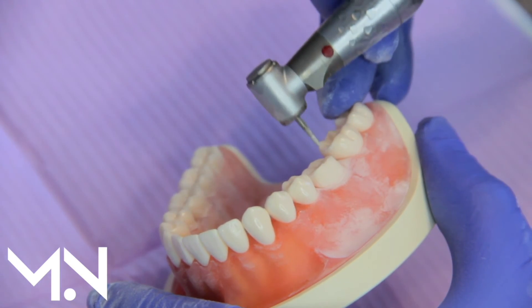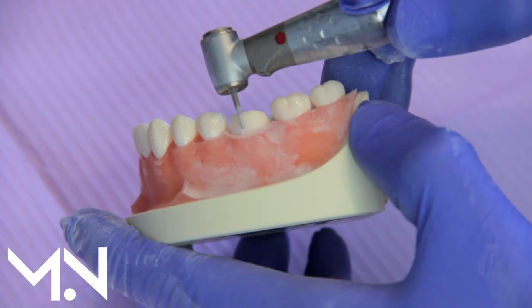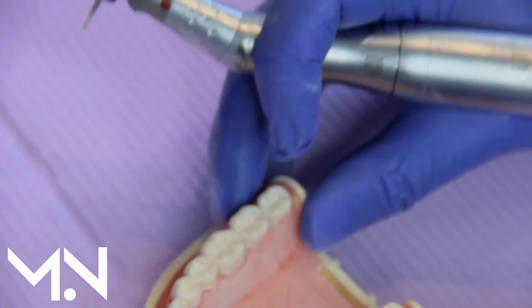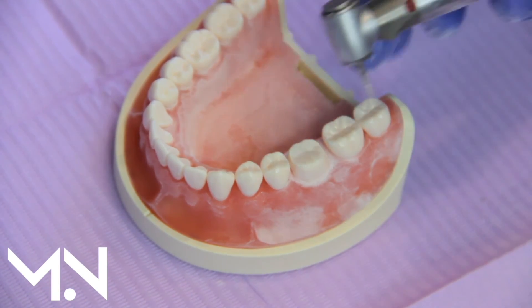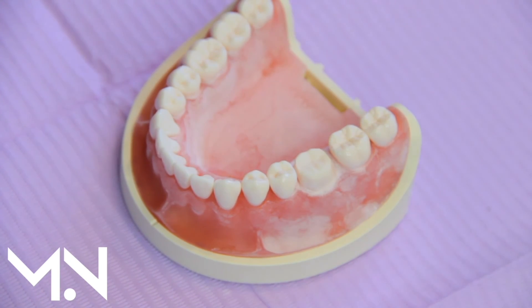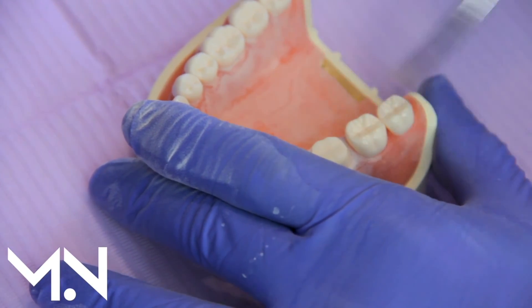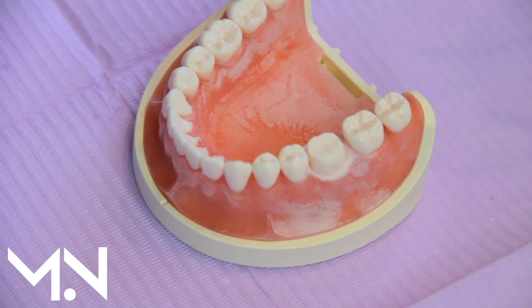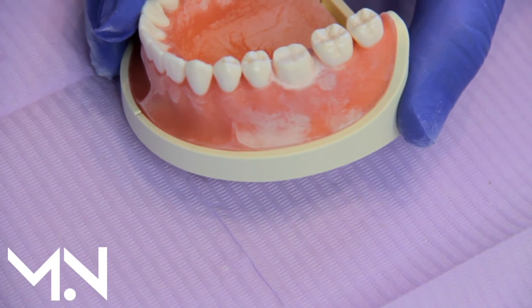Looking from all sides I confirm the taper: both sides tapering towards the center, and from the sides as well. We're essentially done, with still a little bit of refining I would normally do. But very important — I would never normally prep this tooth for a crown. You can see how much tooth we took away to supposedly strengthen a tooth that had problems from the previous silver filling and cracks.